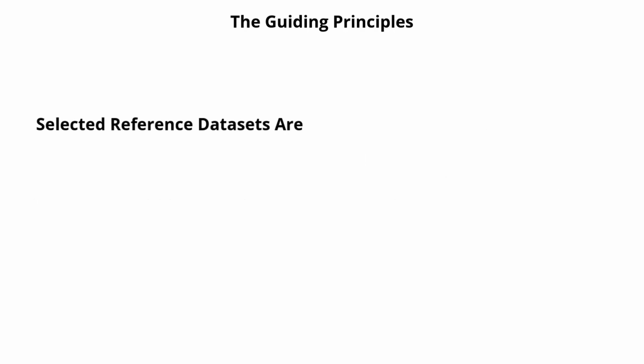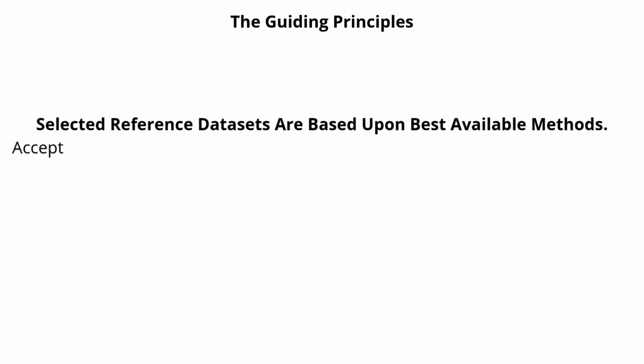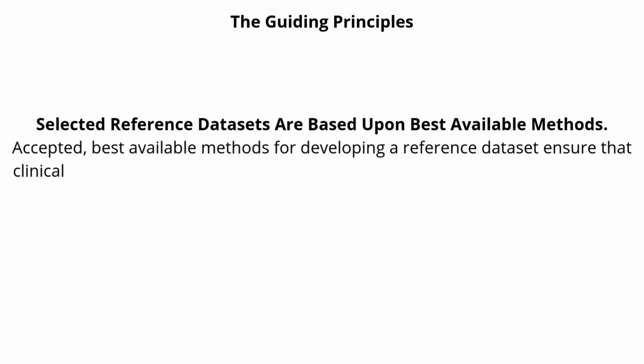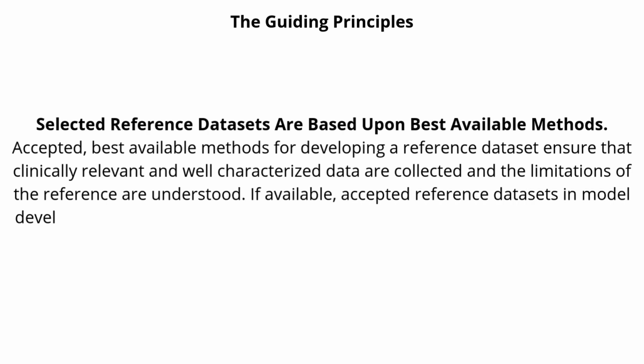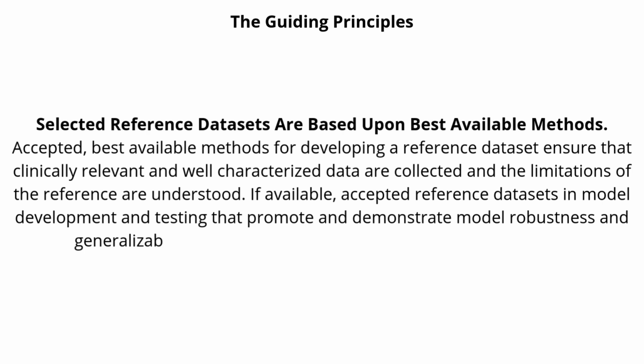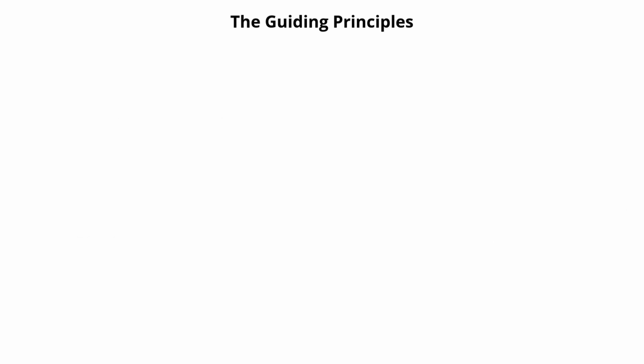Selected reference datasets are based upon best available methods. Accepted best available methods for developing a reference dataset ensure that clinically relevant and well-characterized data are collected and the limitations of the reference are understood. If available, accepted reference datasets in model development and testing that promote and demonstrate model robustness and generalizability across the intended patient population are used.